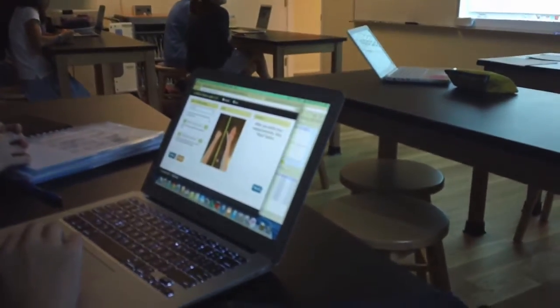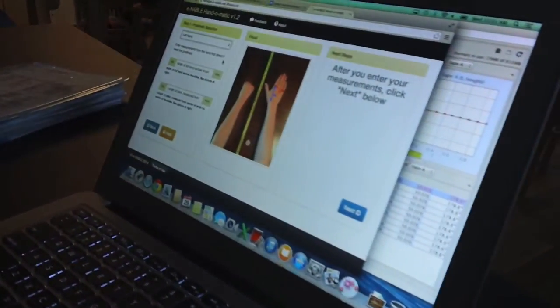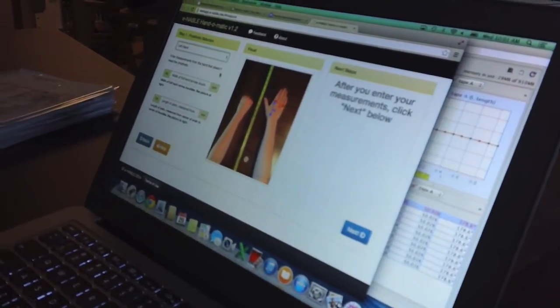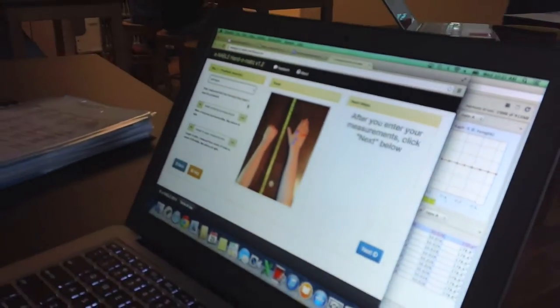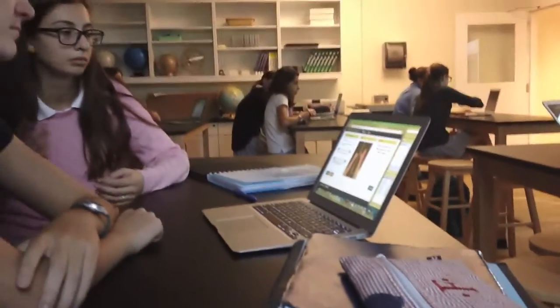We're going to now use these to actually go to the Hand-O-Matic. The Hand-O-Matic is a volunteer-created software that generates the files in the appropriate scale file.